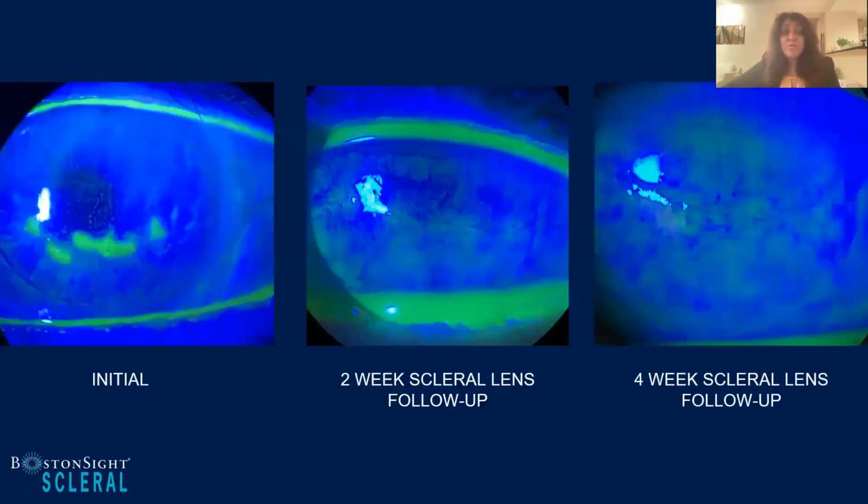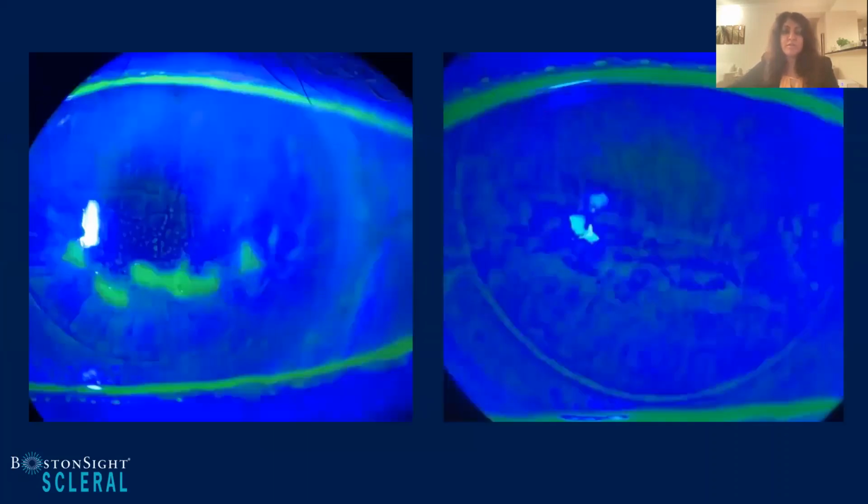And at the 2-week follow-up, we can see that we started to notice some improvement, even more improvement after 4 weeks. What's nice about this is you can see with the photographs, we're able to see the progression of the improvement over time. And we can see that with everything that she tried before, she was not getting resolution, but here we are able to photo document that she was actually getting improvement in resolution with these scleral lenses on.